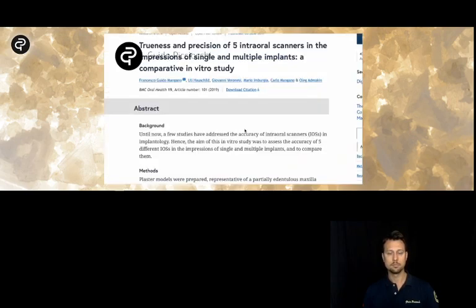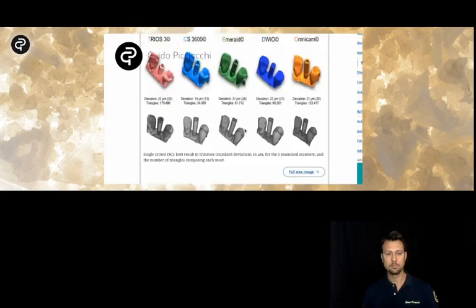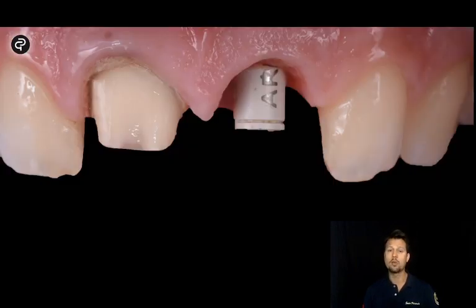Talking about literature, there is an in vitro study on the scan body that shows that on a single implant we can have a detail from 14 to 31 microns. That's good enough. And 14 is really good. It's not just good enough, it's really good, because if we talk about analogic impression, we have to do calculations about what? Contraction of the impression material and expansion of the chalk. So even if we splint the transfer in the open tray technique, we can have contraction in the splinting. So that 14 microns is really a good number. We can say that scanners today are really precise.